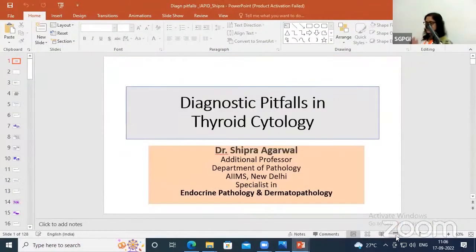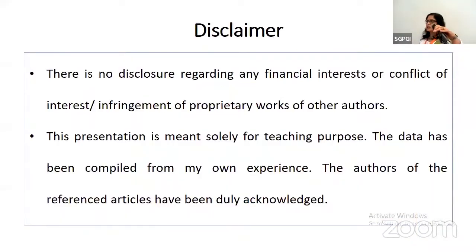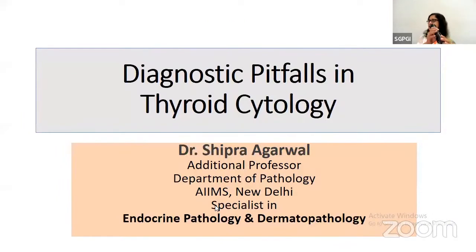So I have been given 40 minutes. This is going to be a case-based presentation. I have about 16 cases. So without much ado, let's start.